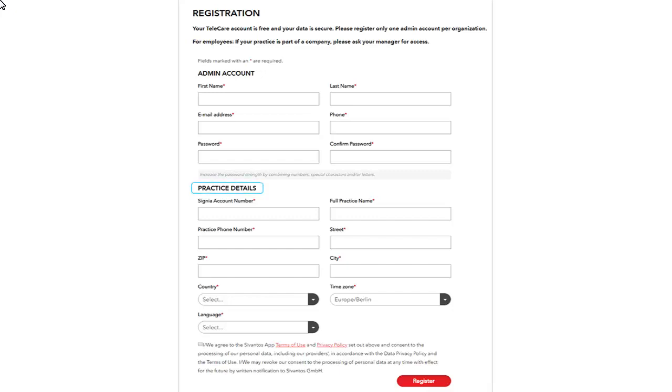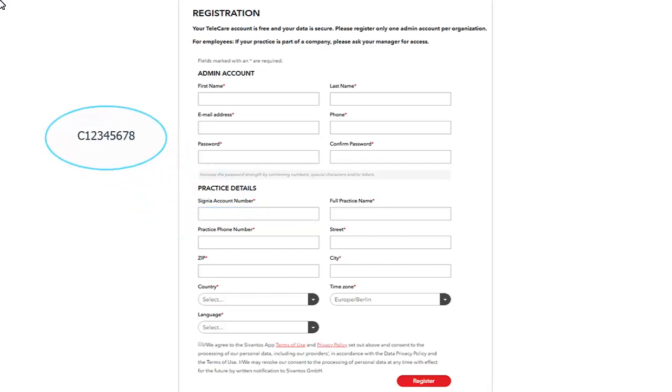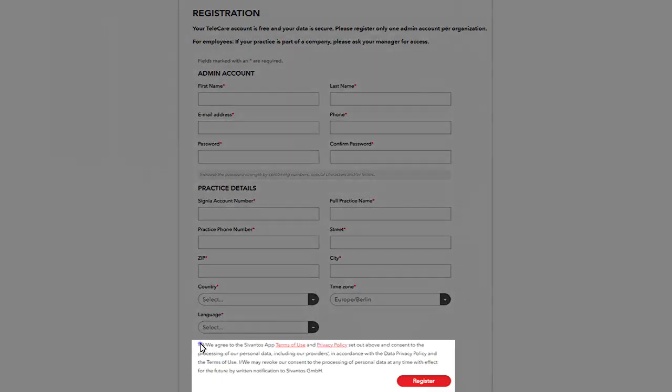Select Practice Details from the menu and insert the Signia account number of your practice. It is the eight digit number with a C at the beginning provided by Signia. Agree to the Terms of Use. Click Register.